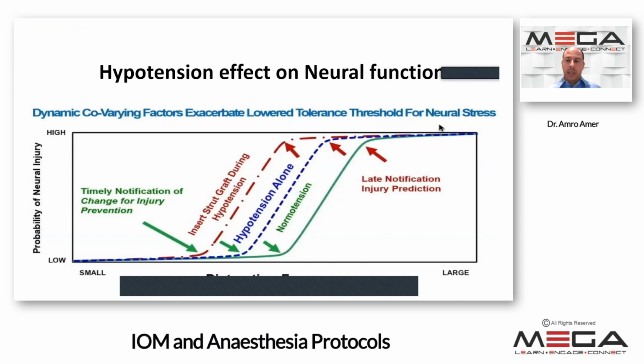We prefer in the surgery, of course, and I know you guys agree with that, to keep the drugs at maintenance dosage as stable as possible. For example, if we do TIVA, there is a machine called TCI. It really gives an accurate, controlled, stable drug maintenance dosage, so it won't affect the patient's vitals, and again that will make our signal stable.